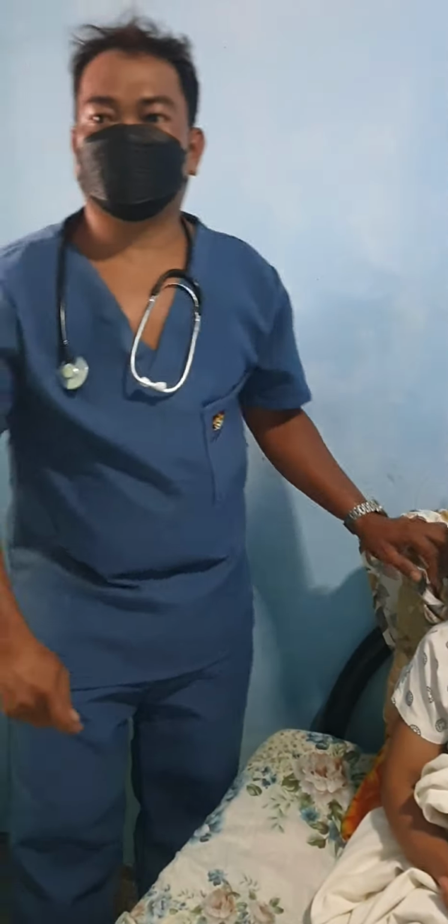Raise the bed to a comfortable working height. This will prevent biomechanical injury to the health care provider. Agree on a signal the patient can use if they wish to pause during the procedure.